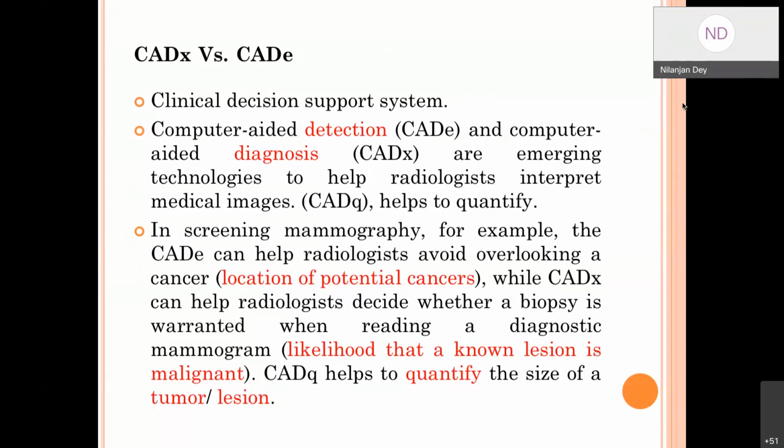Now, if you go through the different medical image modalities, starting from CT, mammogram, MR, ultrasound, radiological images, ophthalmo images, derma images, endoscopy, etc., you will see that almost 75% of the image modality covers radiological images. Under radiological images, the CT, mammogram, MR images or ultrasound images will come. So these cover the radiological images. So CAD systems we basically deploy on radiological images.